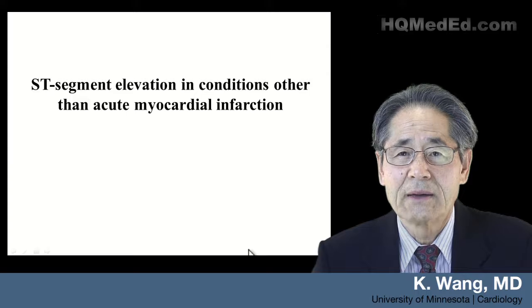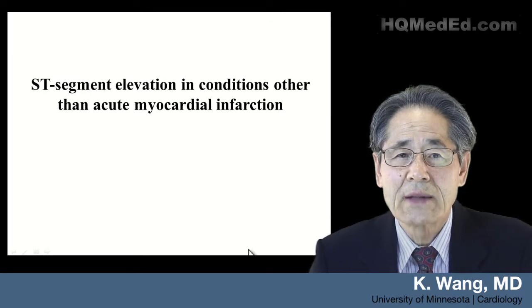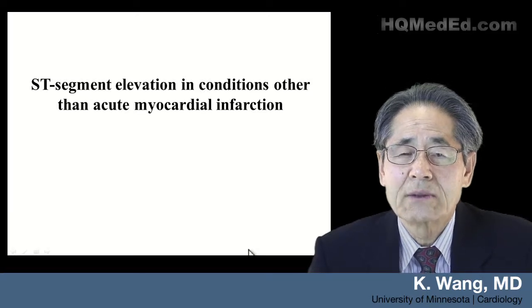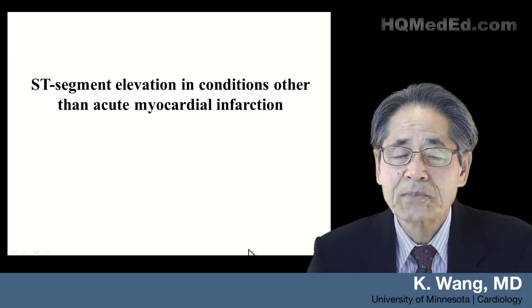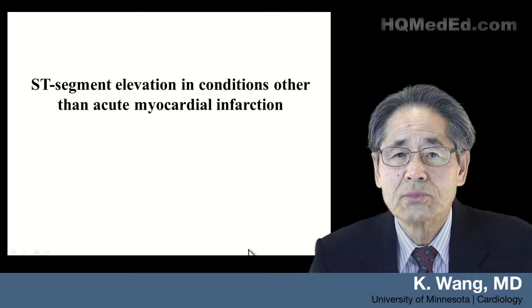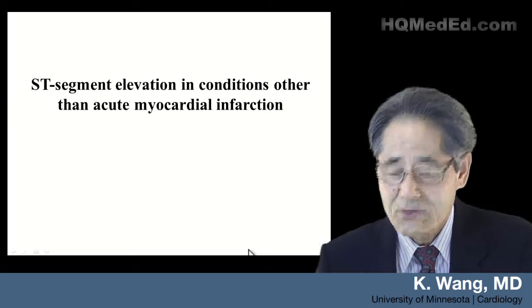I'm thankful for that. This morning, I'm going to talk about ST segment elevation in conditions other than acute myocardial infarction. As you know, when a patient comes in with a chest pain, the first thing that you would like to know is the ECG, whether there's a ST elevation or not. There are many other causes of ST elevation besides myocardial infarction, so it will be very important to be able to tell them apart. In fact, the most common ST elevation is a normal ST elevation. I will come back to that later.